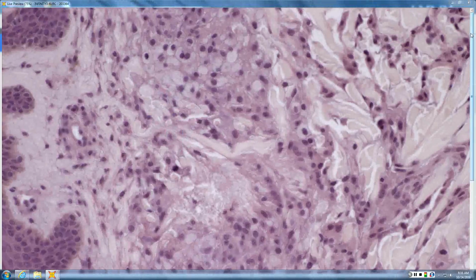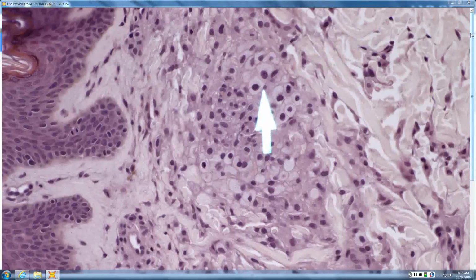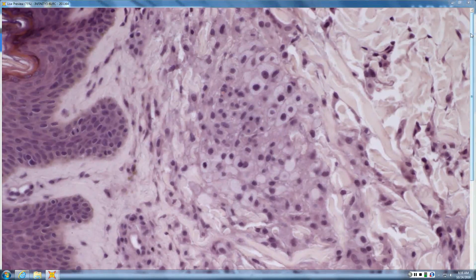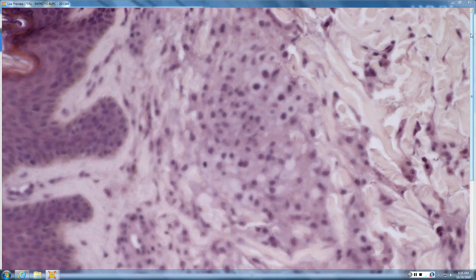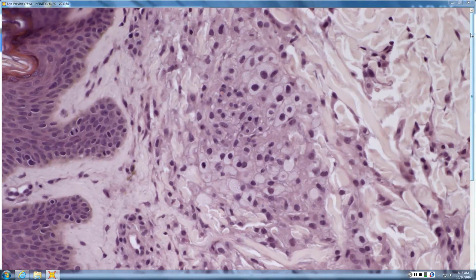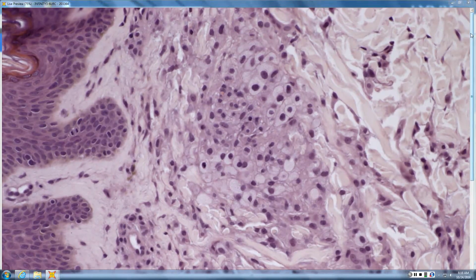You are correct, although that has no cutaneous manifestation. But when you tap a knee, it looks similar. But these are xanthoma cells. Eruptive xanthoma. So it would be an eruptive xanthoma. And that is really important because you will look at eruptive xanthoma and you will think gout, because you're seeing feathery crystals, palisaded granuloma. The hint is the xanthoma cells in the periphery.